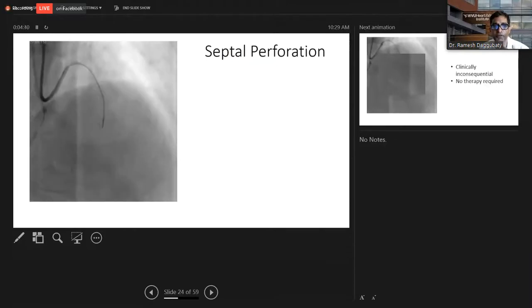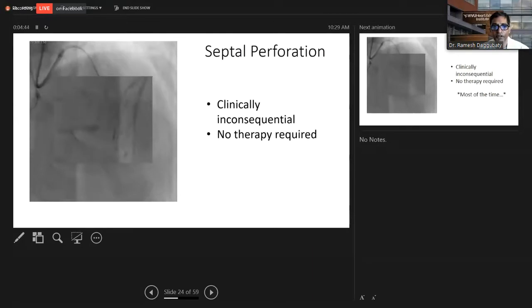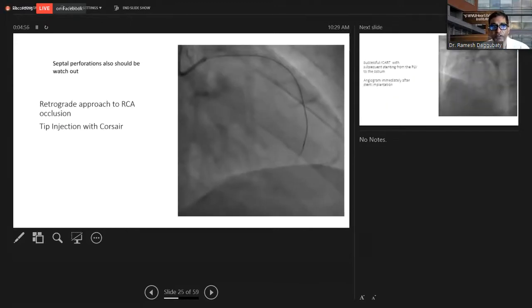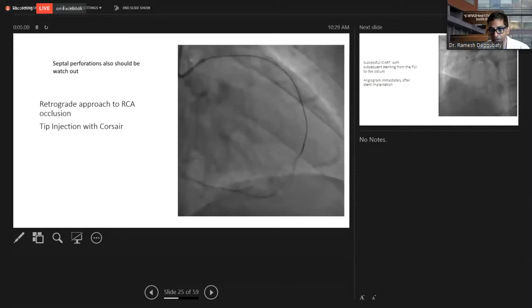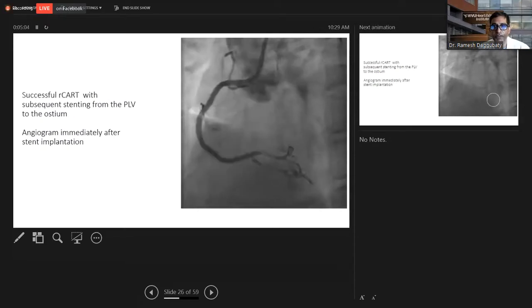So septal perforations, again, are very common in retrograde PCI for CTO, but most of them are clinically inconsequential, and no therapy is required. And I think that is the biggest thing, that God is always watching over our patients and us. But sometimes the septal perforations are drastic because we keep injecting a lot with the microcatheters.